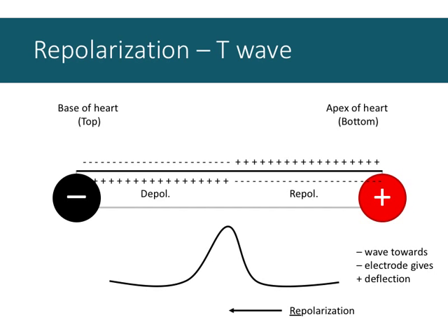But we can observe the T wave. The T wave is the repolarization of the ventricles. Nothing else is going on at that time. And the T wave in any lead 2 ECG is always an upwards little bump. Not always an upwards bump. We'll see in the 12-lead discussion where that might not occur. In a healthy individual with electrodes placed properly, it's an upwards deflection. It's a negative wave towards a negative electrode, which gives a positive deflection.